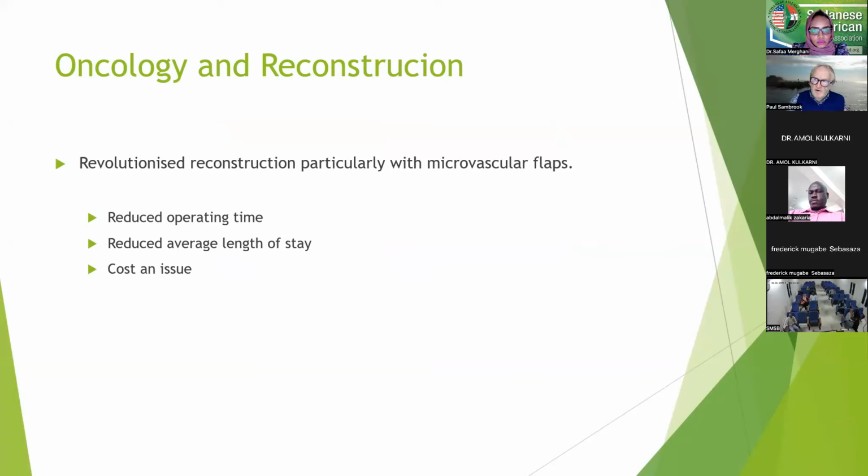Following on from that, we looked at how we might use virtual surgical planning in oncology and reconstruction. And really, we can get to a position in orthognathic surgery a number of ways. But really, virtual surgical planning has revolutionized the management of oncology and reconstruction with microvascular flaps.